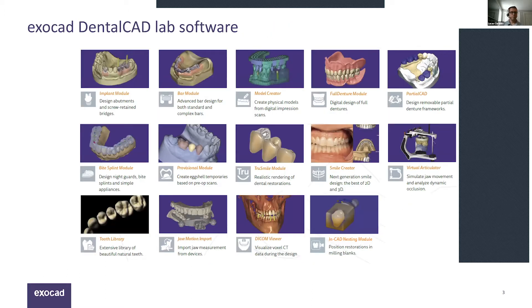ExoCAD is a modular software — you pay for what you need. The core product captures all your fixed restorations: crowns, bridges, veneers, inlays, onlays. On top of that there are various specialty modules. Today we're going to focus on the more commonly used modules for 3D printing, ending with a live demo of the bite splint process.